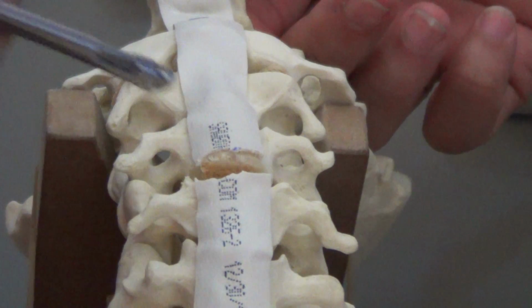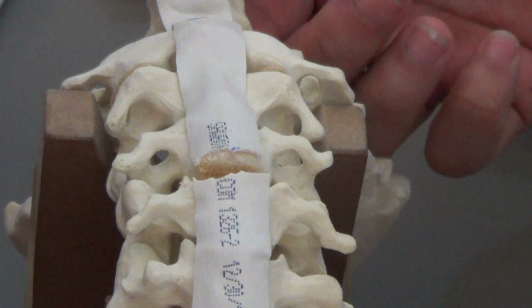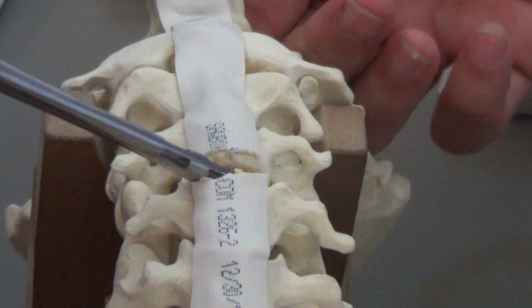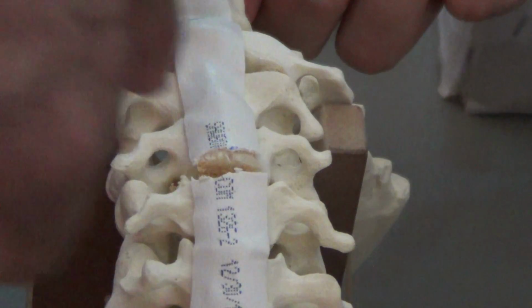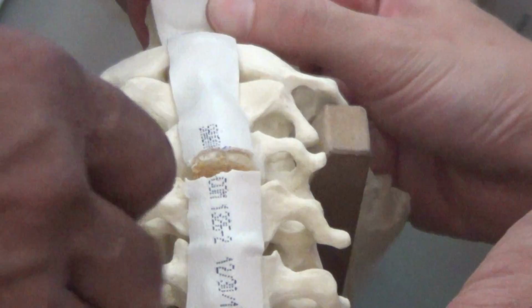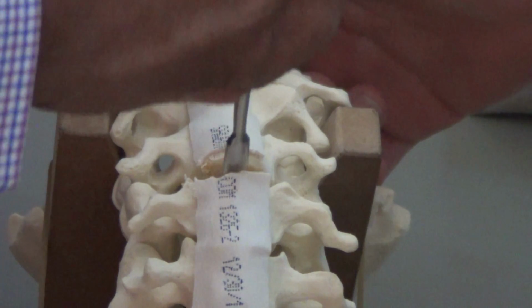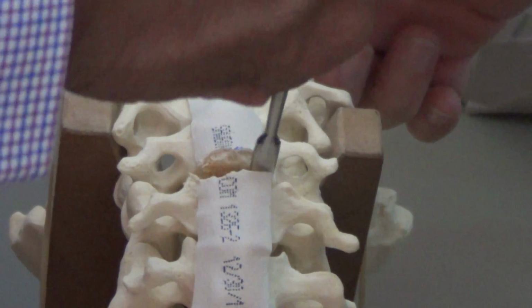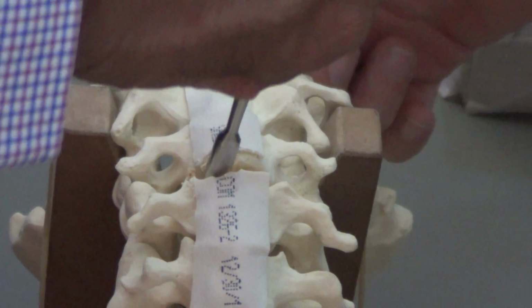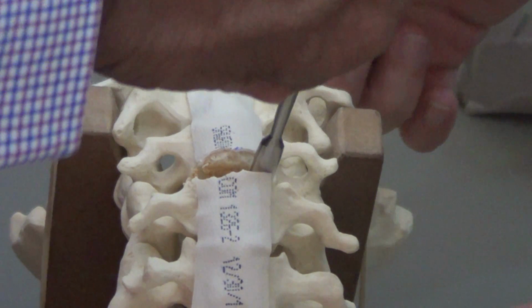In this case, you must be extremely careful. Now, before I even come to the posterior longitudinal ligament, after taking off the disc, before I touch the posterior longitudinal ligament, I use a burr and also burr the cartilaginous end plates. You burr these cartilaginous end plates till you find the cortical bone superiorly and inferiorly. And this must also be straight. You have to burr part of the uncinate process. Don't go lateral to the uncinate process.